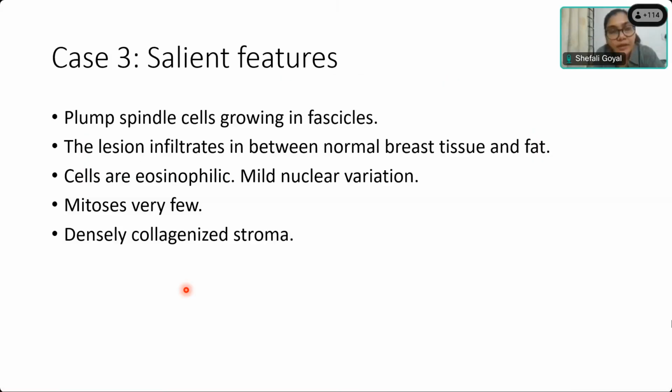So we'll start with, Chef Ali, we'll start with cytokeratin, right? Cytokeratin, yes. Okay, let's see. So you have already enumerated everything.